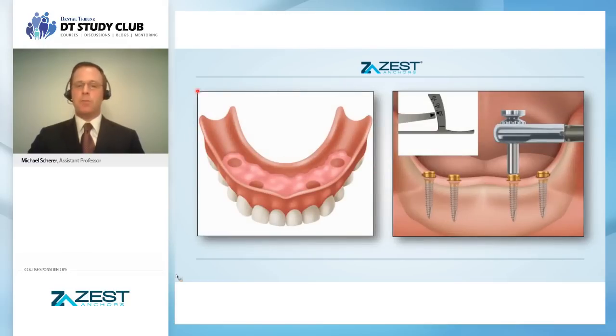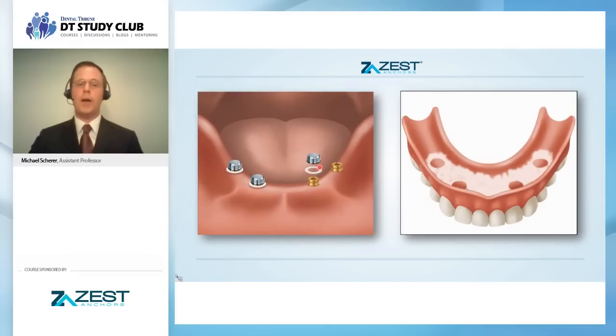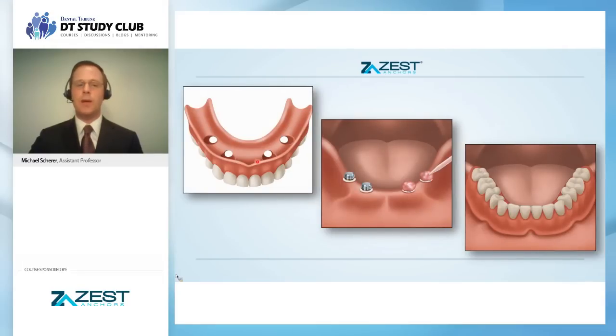Now at this point, as I mentioned before, we're going to verify that everything does clear. And again, I like to do this before I torque. So you can see here now at this point we're going to torque. We're going to attach the white spacers, or if you tend to prefer anything like a rubber dam or Teflon tape, those are all completely viable options, and it's totally up to you and your clinical decision. This is standard locator pickup, what most of you are familiar with. What we're going to do is verify that yes, everything still fits, like you see here, prior to making any sort of major adjustments.